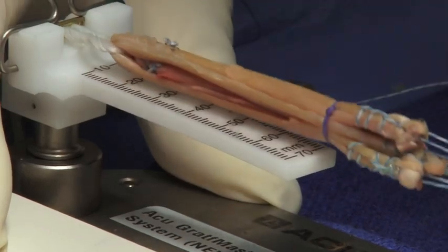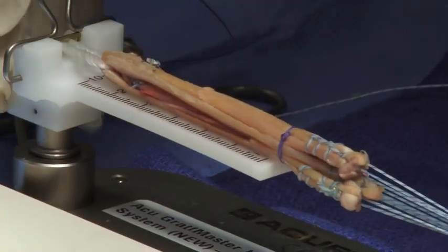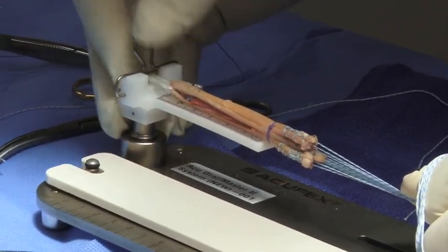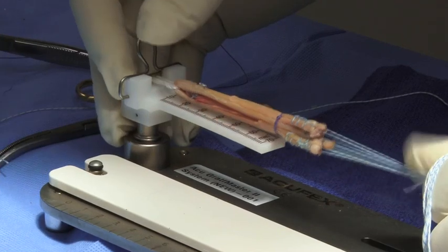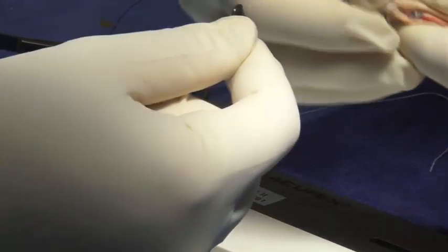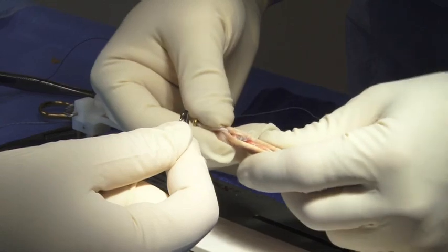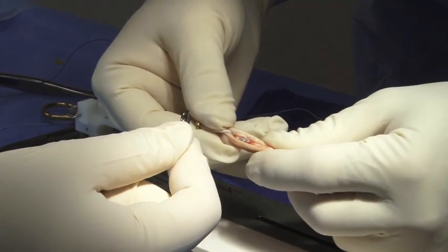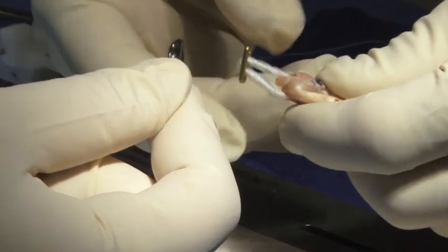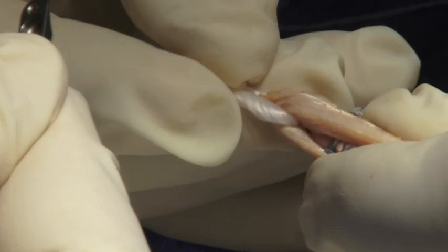We routinely use an extendo component to the suspensory button, which is then put into place. Here you can see that the inner fifth limb of the graft is incorporated inside the four-limbed graft to give it a buttoned, bulleted shape at the end to promote passage, such that the fifth limb does not get caught in the tunnel.